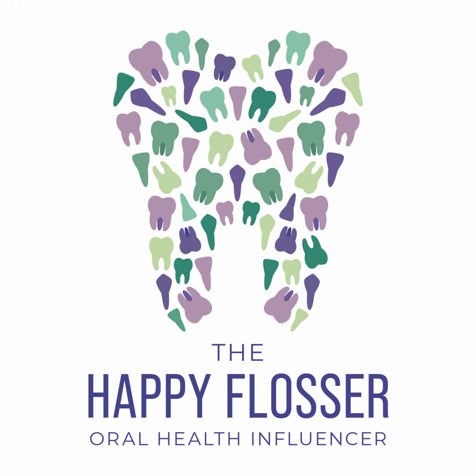The reason why you get air bubbles in your models is because you either did not remove the air bubbles from the stone before you poured it into the tray, or you poured it up too quickly and had that stone kind of wash across the occlusal surfaces a little too fast. So you have anatomy that is required, right? To have an acceptable study model, you have to have the anatomy show up. So when you have voids or broken teeth, that kind of diminishes that ability.